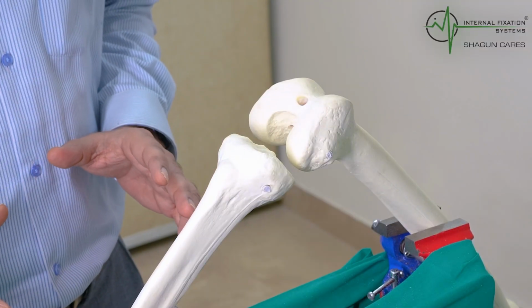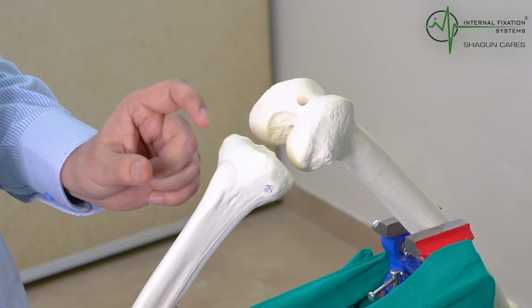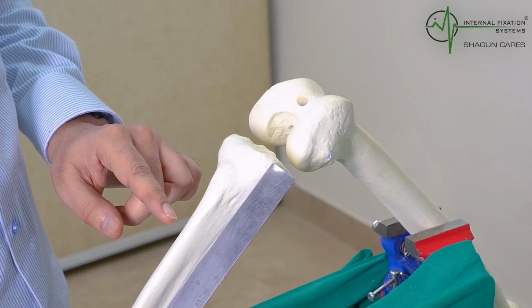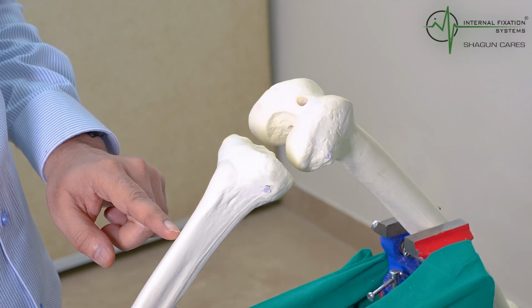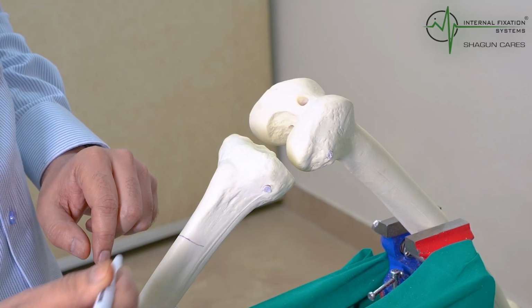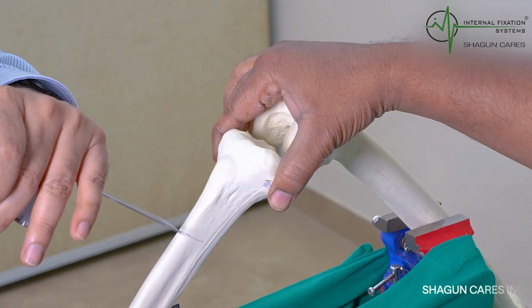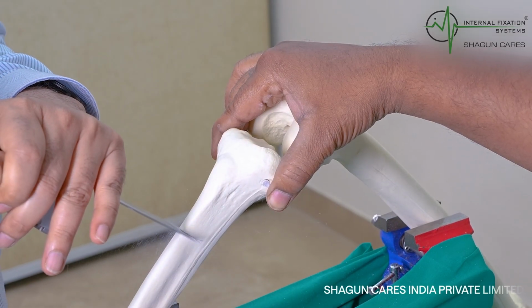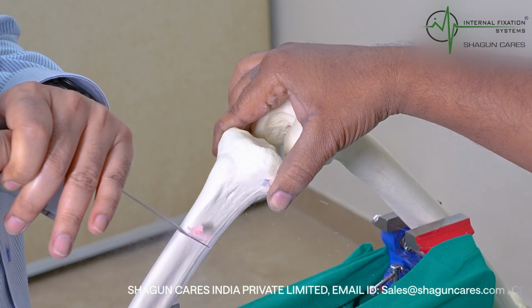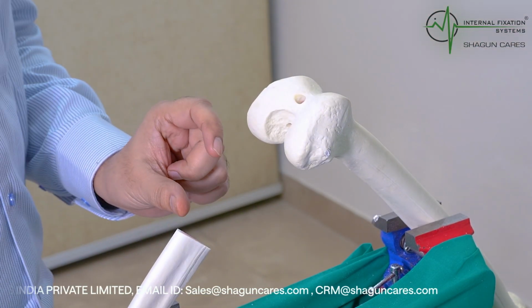So now we are going to show you the proximal tibia resection. Once you have done the soft tissue dissection, the minimum resection is 8 centimeters. So if we look at it from the tibial base, this is your 8, somewhere here, which you need to mark with a pen. Now we are going to take the cut with the saw. Once you remove this, there is a large defect.